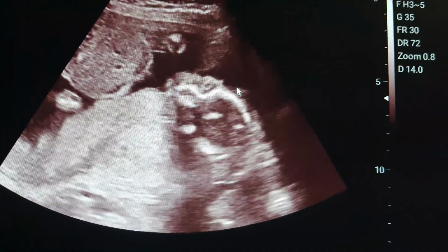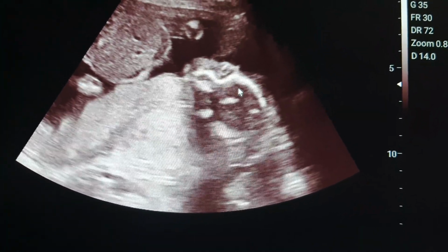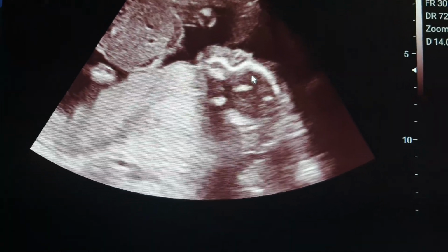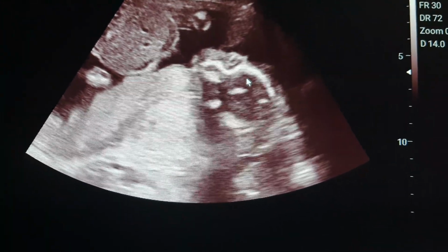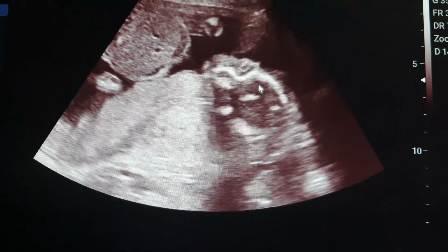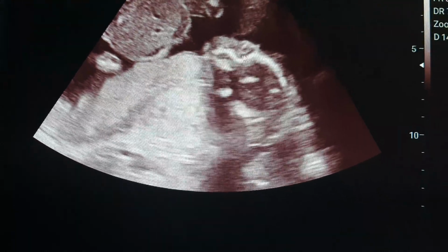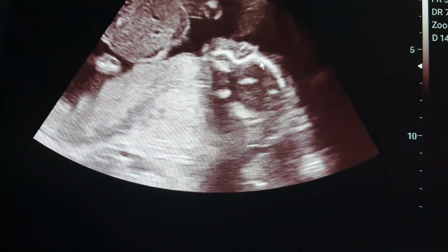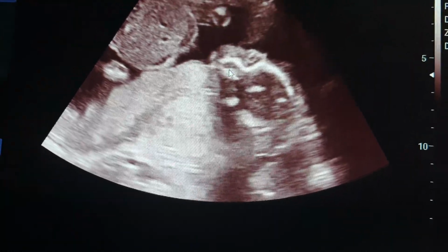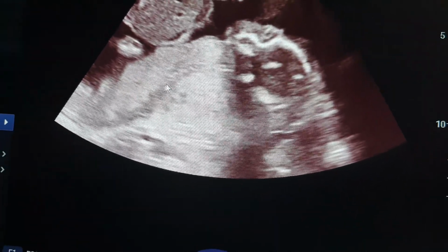In this picture, head apart, of course, that's just a scene. I'm not talking about how to measure the fetal biometry of the head. No, just what is seen in this picture. As you can see, I paused the scene. This is the eye lens of the right eye. The left eye is not appearing here. And this is the nose. This is the placenta. This is the placental border.